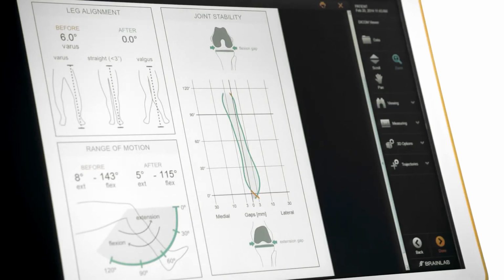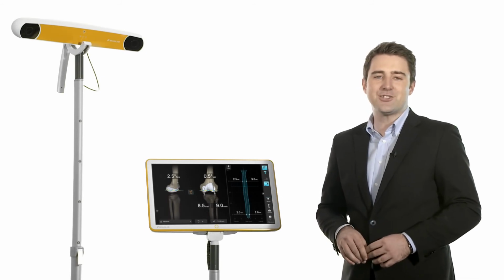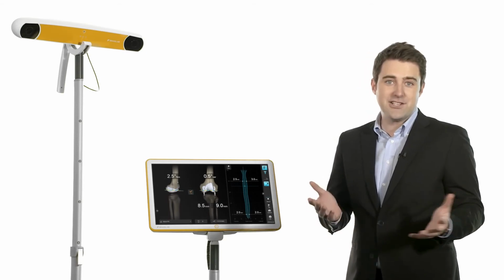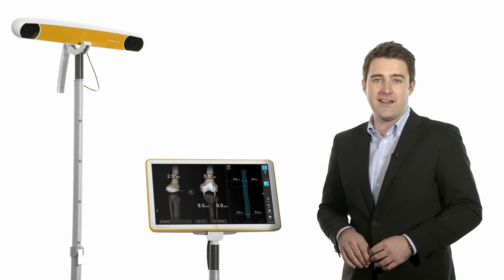After each procedure, a patient report, which is optimized for documentation and communication in daily practice, is automatically generated by the software. The intuitive software approach allows surgeons to adjust to the surgical environment, thereby potentially decreasing surgical time and providing the flexibility to manage unforeseen circumstances on the fly.